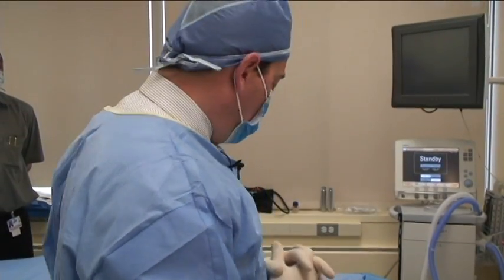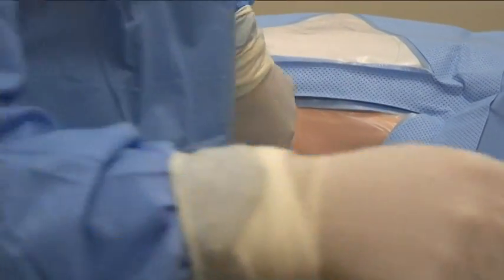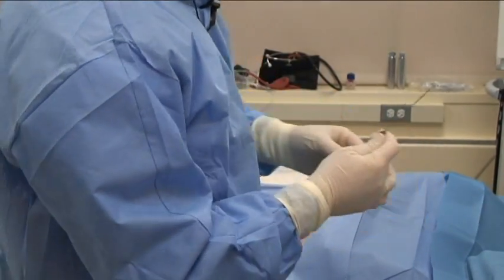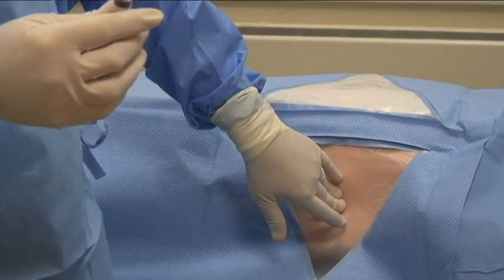So now, at this point, we're ready to begin. So again, we could just review our landmarks, make sure we know where we're going to go. I'm going to go along the top of the rib. At this point, I would take my needle and remove the cover. I've appropriately numbed or anesthetized the area, and it's time to begin.